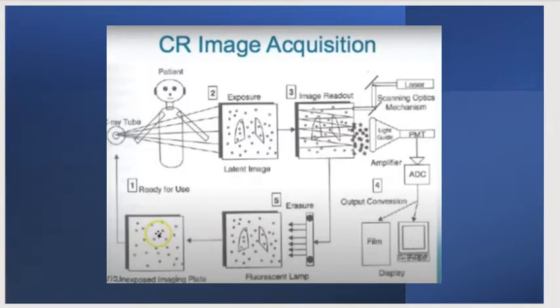Here is a visual drawing of the CR image acquisition for a better understanding.